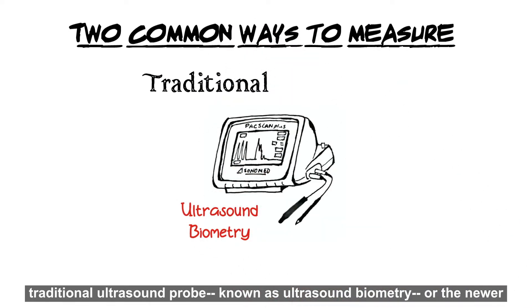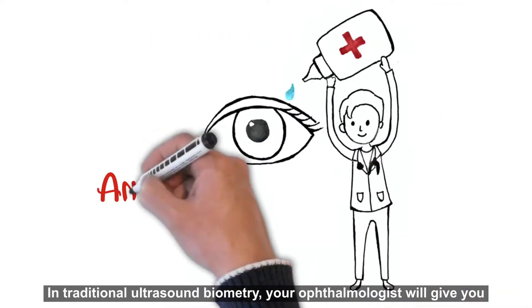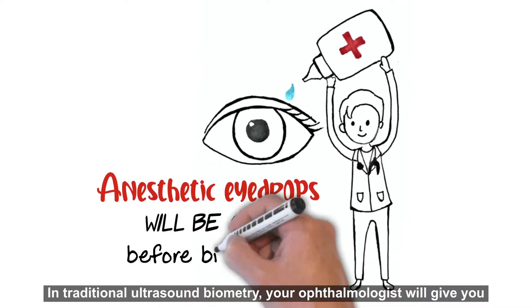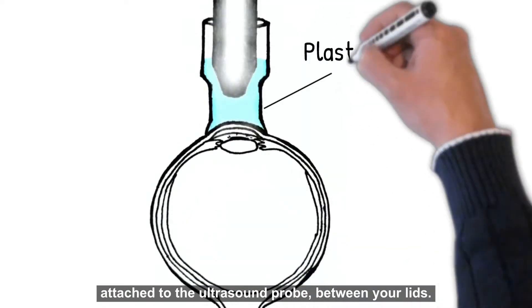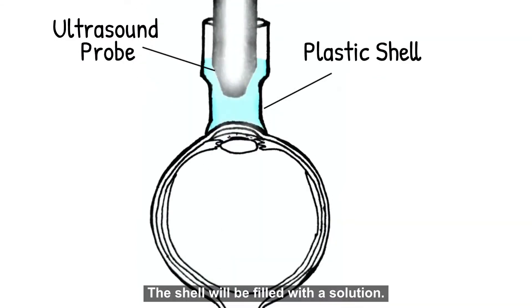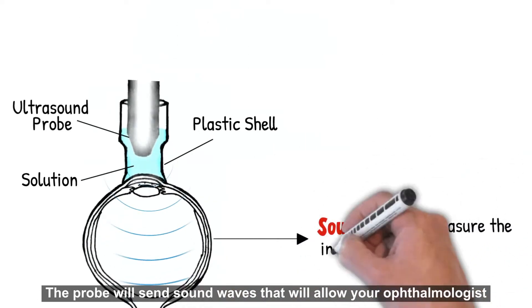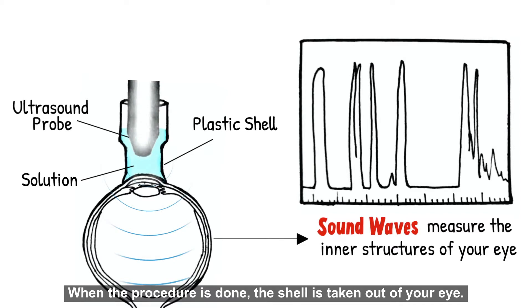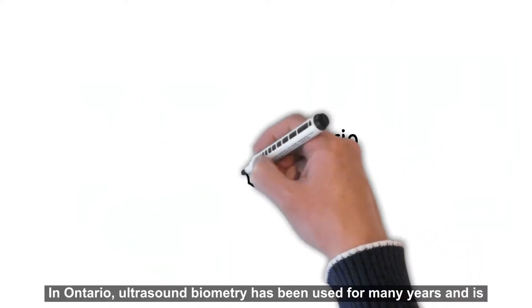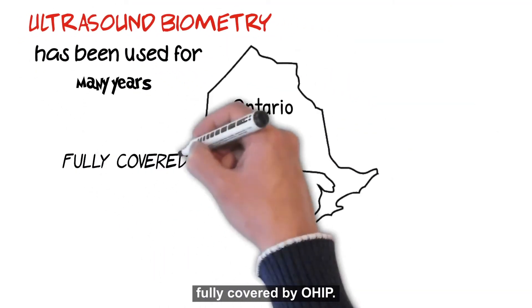In traditional ultrasound biometry, your ophthalmologist will give you some anesthetic eye drops and then place a plastic shell, which is attached to the ultrasound probe, between your lids. The shell will be filled with a solution, and the probe will send sound waves that will allow your ophthalmologist to measure the inner structures of your eye. When the procedure is done, the shell is taken out of your eye.